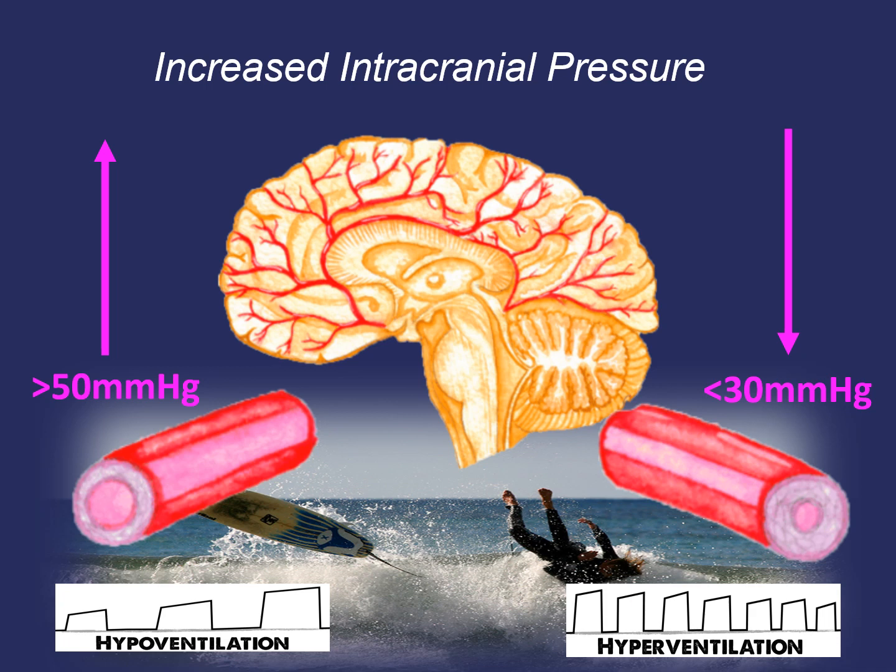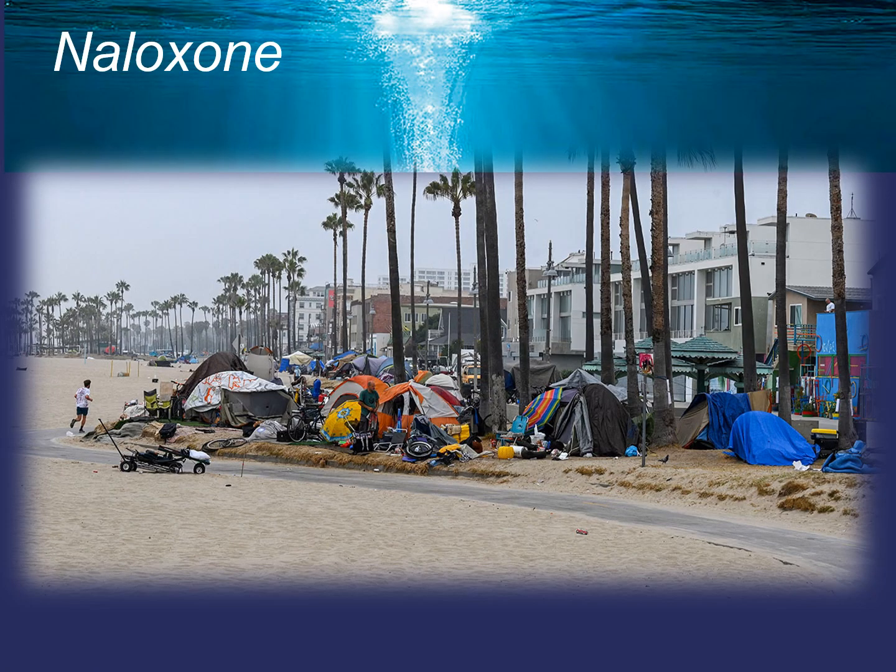Instead of ventilating to titrate SpO2 levels, ventilate to titrate your end-tidal levels to achieve a normal level. Continuous end-tidal CO2 monitoring in trauma patients is recommended to further prevent any brain damage.